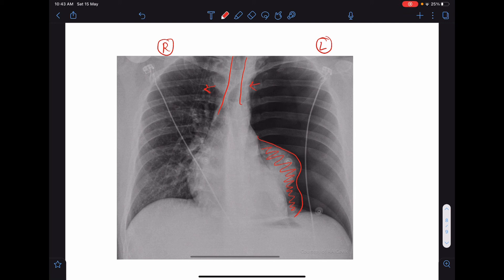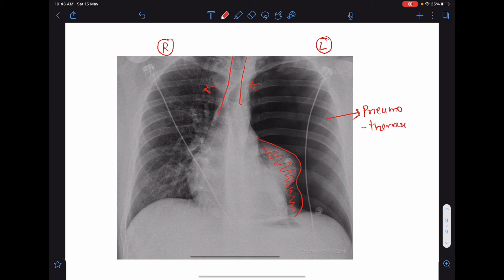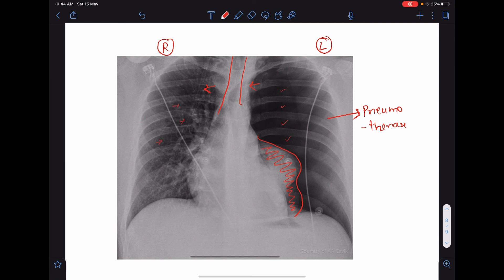This is because in the left hemithorax, there is collapse of the lung which is associated with pneumothorax. So, in the left side, there is pneumothorax, and probably pneumothorax is the reason for the collapse of the left lung. How do we know that there is pneumothorax? We can see that the lucency is increased in the left side if we compare with the right side. In the right side, we can see all the bronchovascular markings which are completely absent in the left side. And the trachea is pushed towards the opposite side. So, these are the signs from which we can know that there is left-sided pneumothorax, and because of the pneumothorax, the lung is collapsed. This is how we can identify a lung collapse from a chest x-ray.